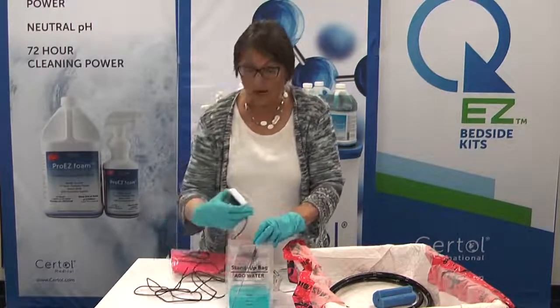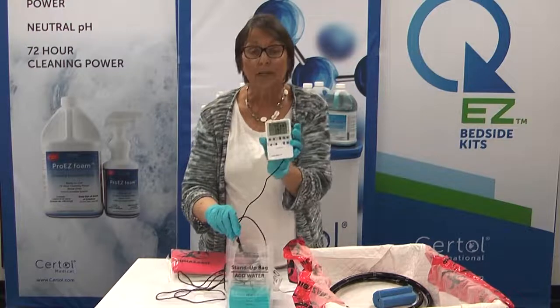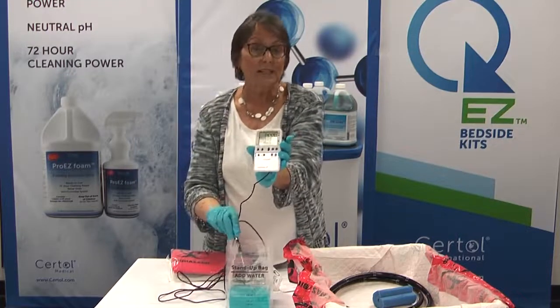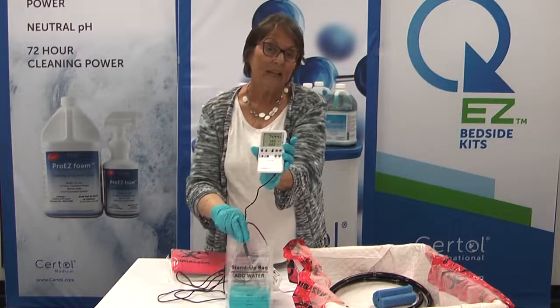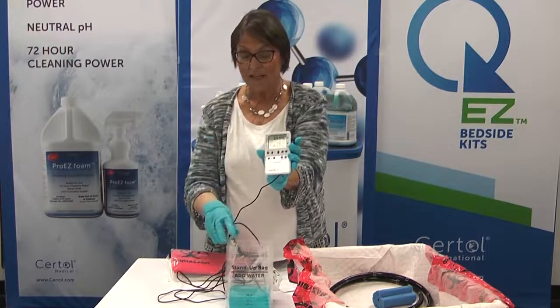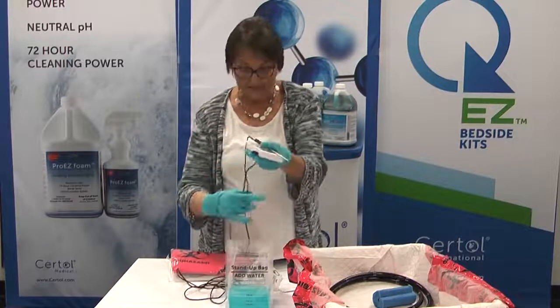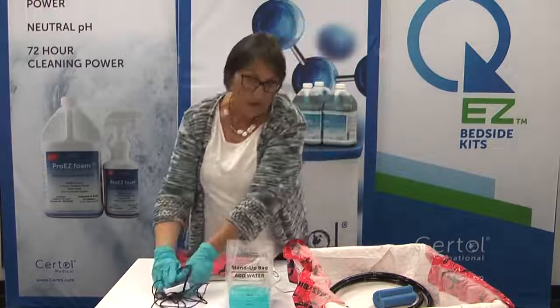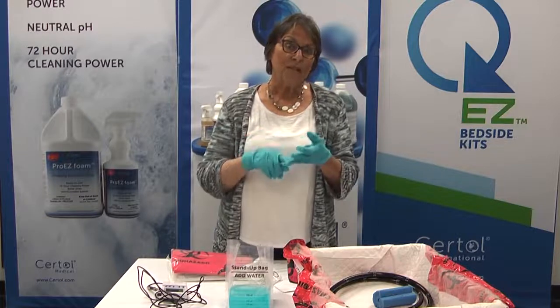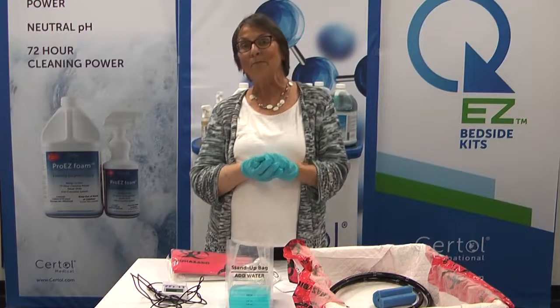We're also going to see that this is happening at room temperature. Unlike some enzymes that require 90 degrees or more to activate, using a calibrated lab thermometer we're seeing about 74 to 75 degrees — that's about room temperature typically encountered in an endoscopy department. So your solution is active, it has active enzymes, and it's working at room temperature — both very important features, and it's fast. That's the Certol QEZ Bedside Kit.